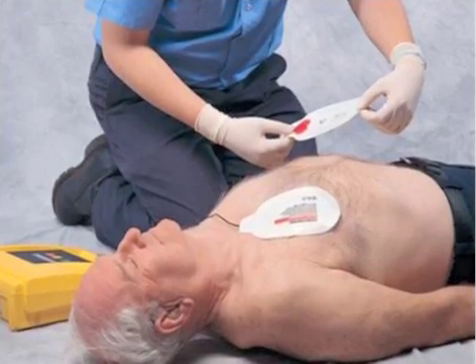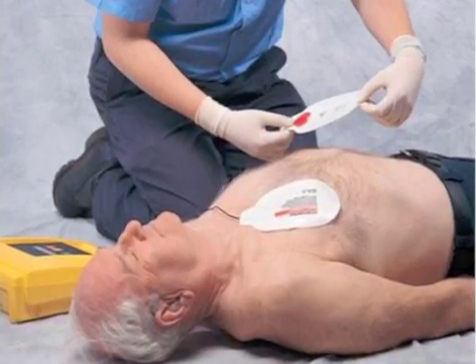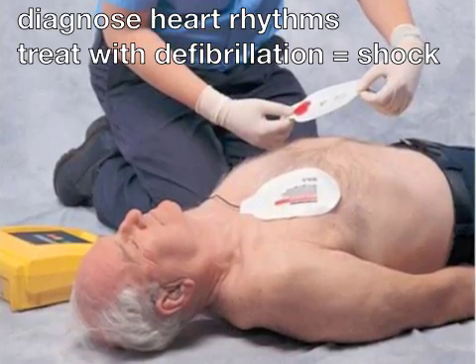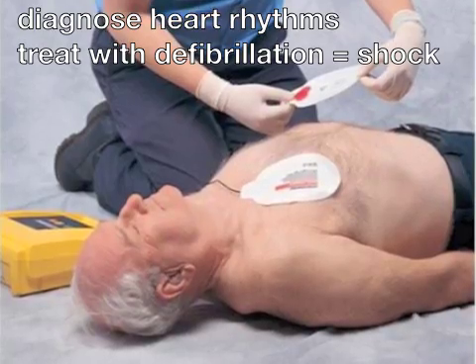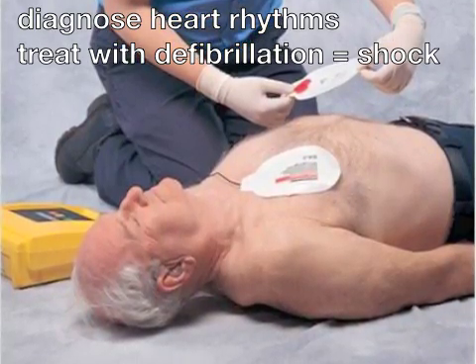The purpose of an AED is to automatically diagnose cardiac rhythms and treat the shockable ones with defibrillation — the application of electrical therapy, also known as electrical shock.